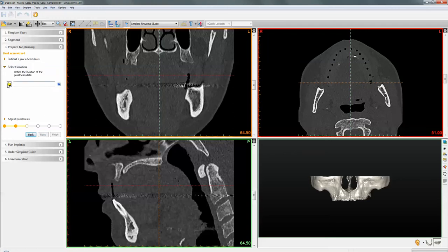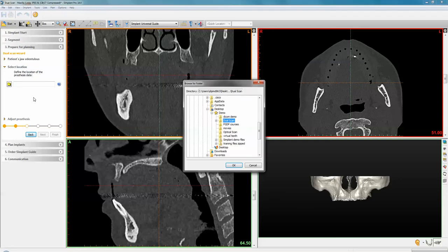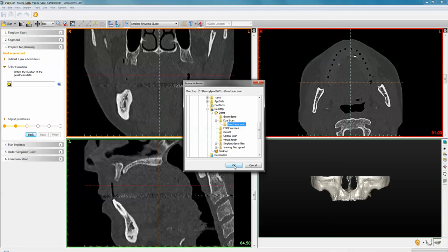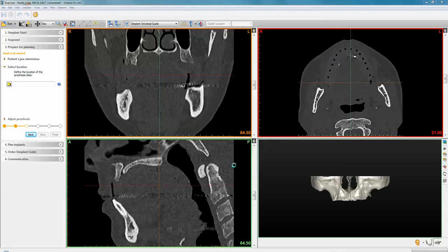A folder dialog will appear for you to locate where the prosthesis scan is stored. I've stored it in the same folder as my patient scan, split into two sets of files and labeled as the prosthesis scan. This is still in individually sliced raw DICOM format — I have not opened it or created a Simplant file from it. Click OK and it will show a preview of what's in that DICOM file.